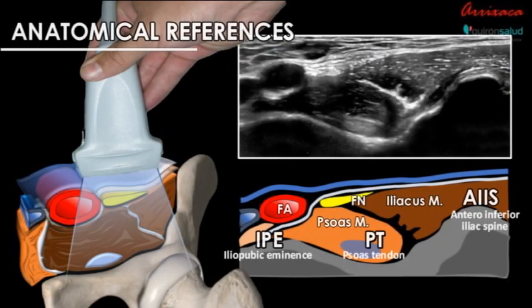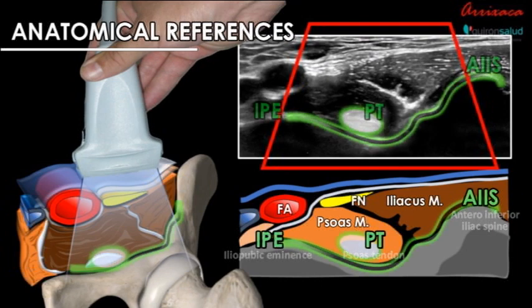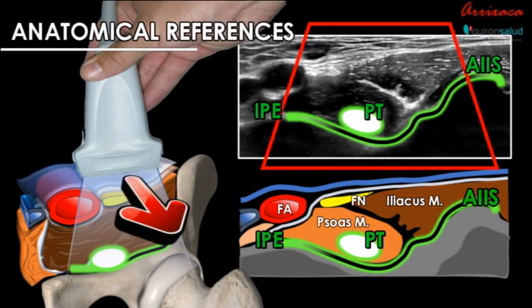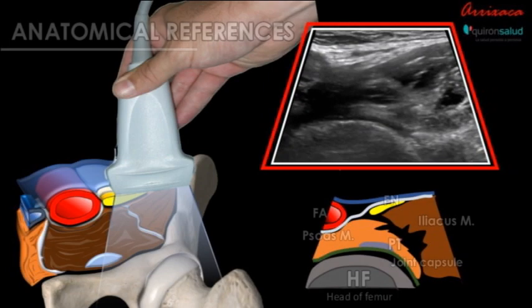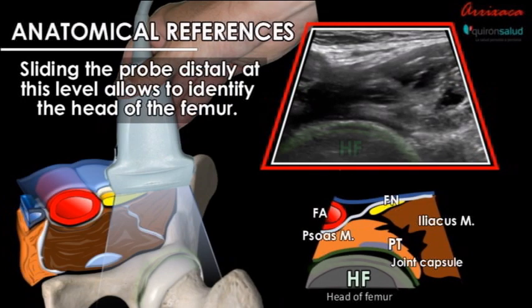Our anatomical references for the PENG block are the iliopubic eminence, the anterior superior iliac spine, and the psoas tendon, which lies between the described bony references. By sliding the probe distally or with a gentle tilt, we are able to identify the head of the femur and the joint capsule of the hip.